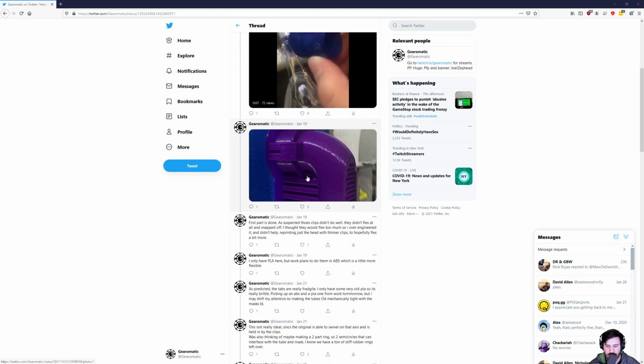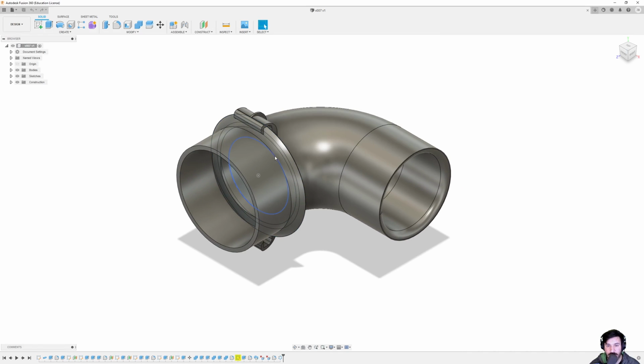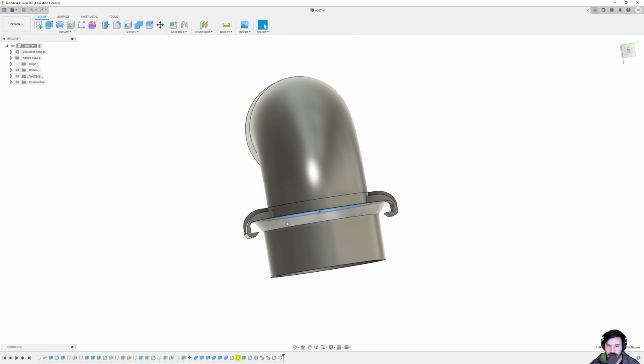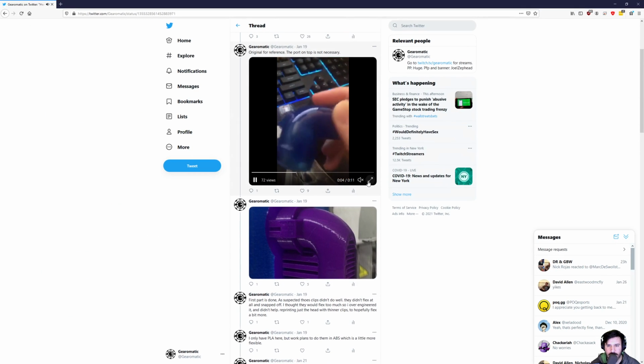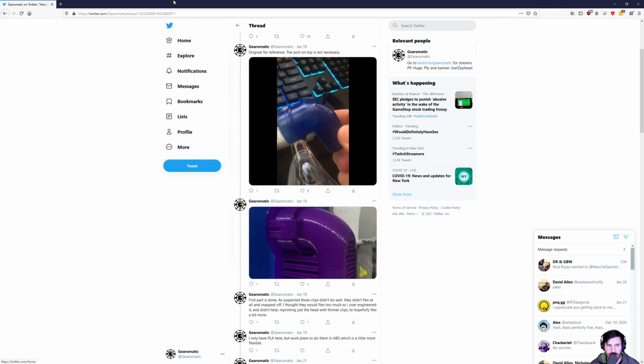This was the initial first print, which is this right here in my hand. And one of the biggest problems, and if I shift over here, one of the biggest problems I was having is, this is the final version, by the way. I don't want to do that. These clips right here. If you look at this, where this interlocks with the mask, you can see those clips hold it in, and it swivels on those clips. And I was having a big issue with that.